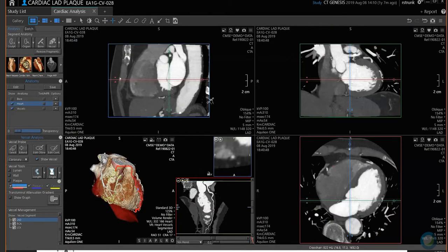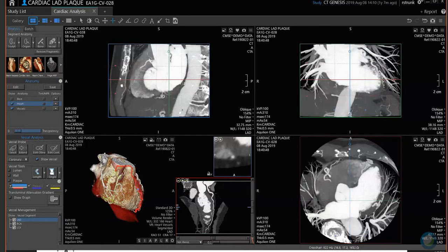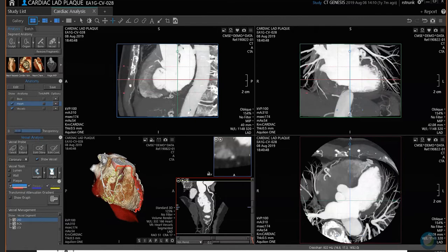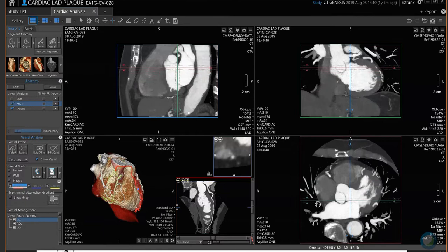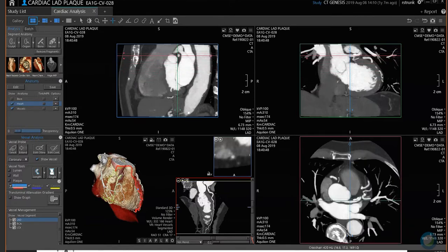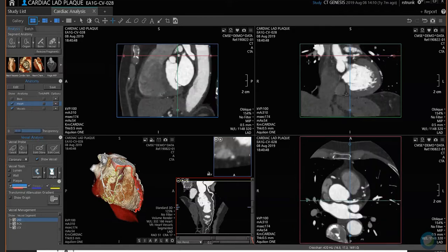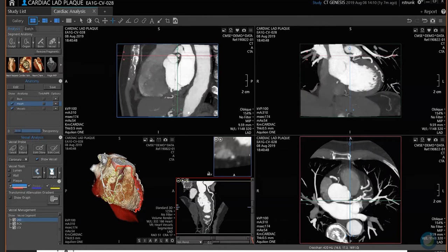A few things I find useful: sometimes you want to make a thicker MIP so you can see the layout. Right now they're five millimeters. On the crosshair, you just pull it across and you can change the thickness on the fly. If you want a thick MIP to see where the branches are going, you can grab and do that on any of these viewports to make it thick.